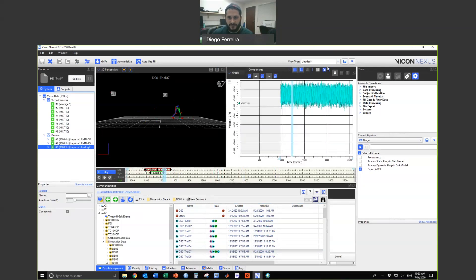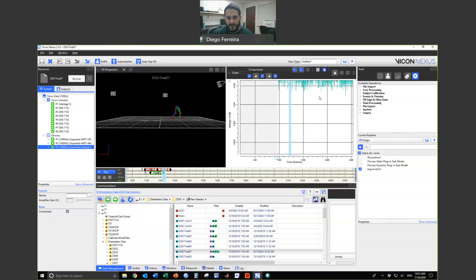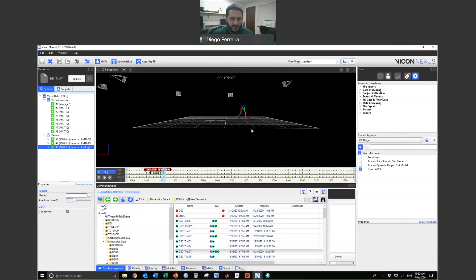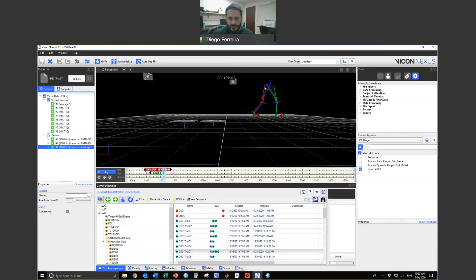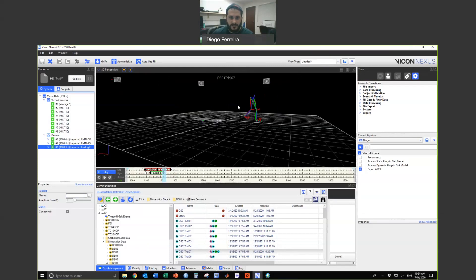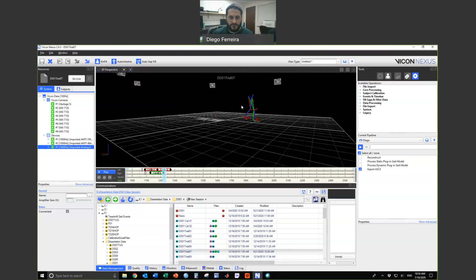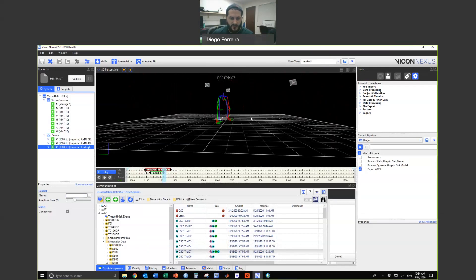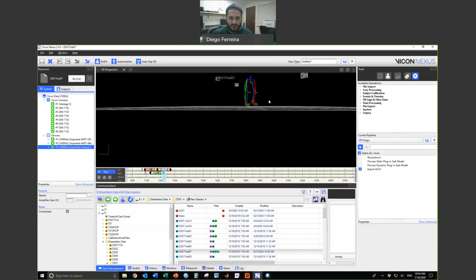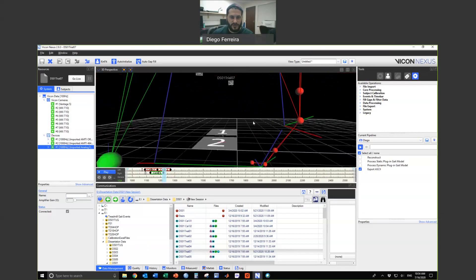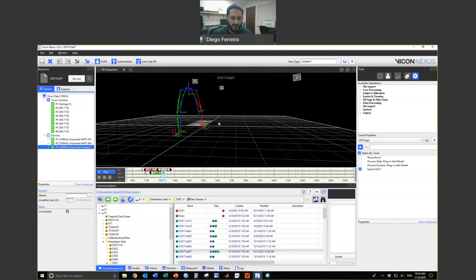You can left-click and drag the graph up and down, and zoom in or close the window. In the main workspace, if you right-click you can zoom in and out. If you left-click you can rotate in any direction. If you double-click you can pan — moving the view around. This makes it pretty useful when you need to zoom in and navigate around the workspace.